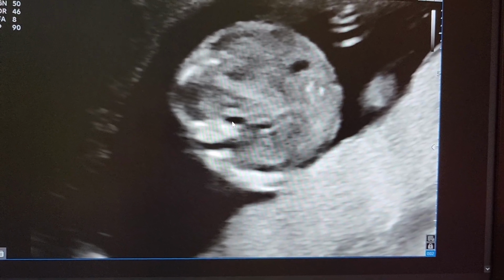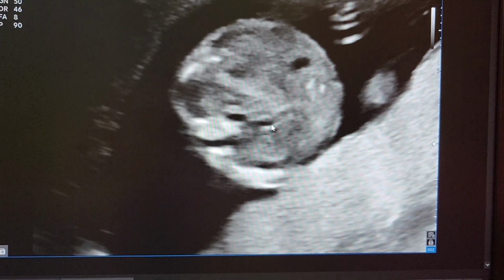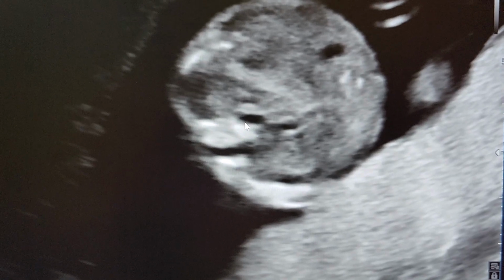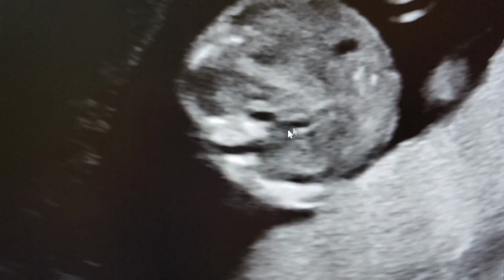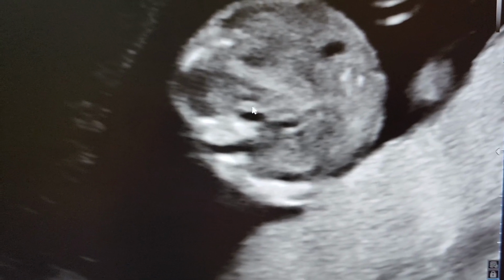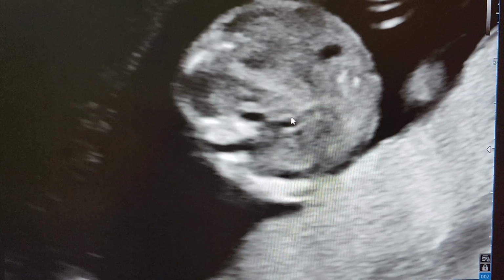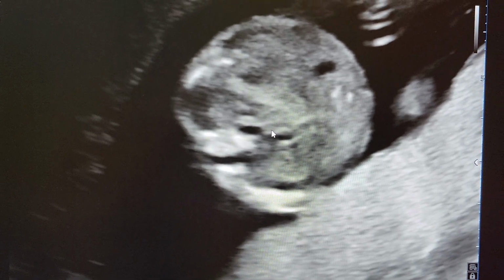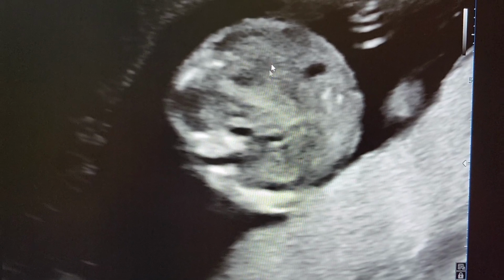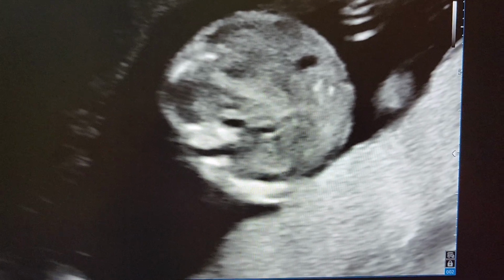You can see the aorta is on the left side, the IVC is on the right side. The aorta is immediately anterior to the spine and the IVC is slightly more anterior to the spine. So this is the normal relationship of aorta and IVC. The abdominal situs is normal in terms of vasculature. Also the liver and stomach had a normal anatomy.